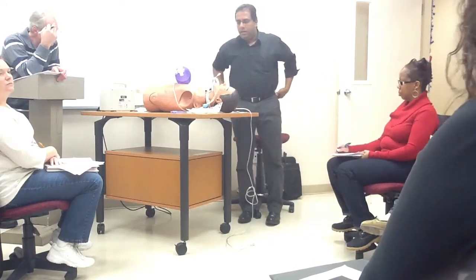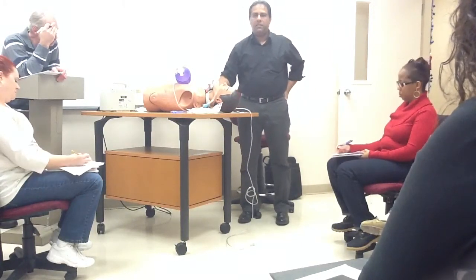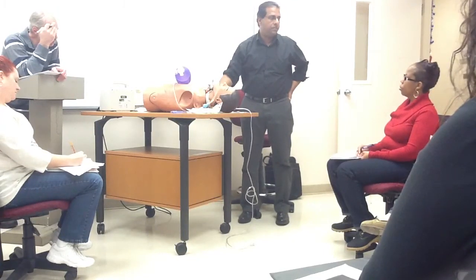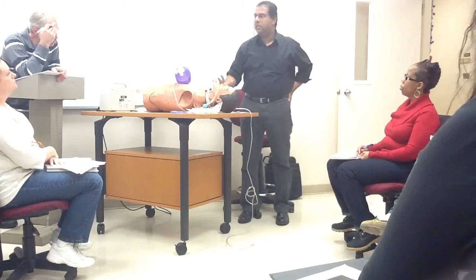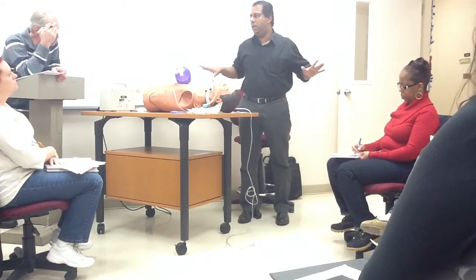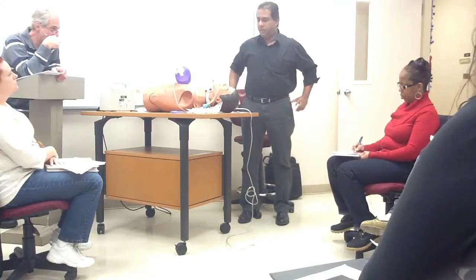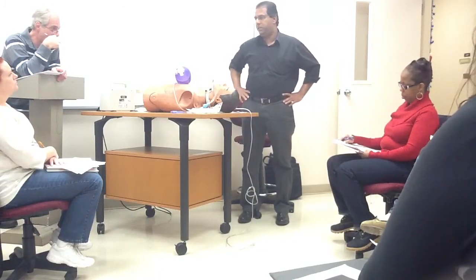The first one I'm going to show you is, just imagine this patient does not have an inline suction catheter. This patient is on a ventilator at this point with a trach. No inline suction catheter in place, for some reason. The doctor didn't want an inline, but they want you to suction the patient. My first question is, how do you hyperoxygenate this patient?